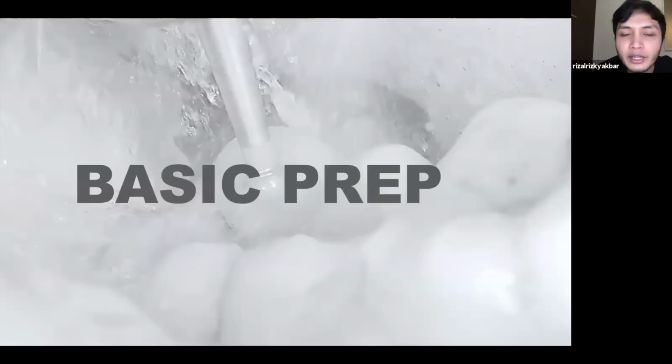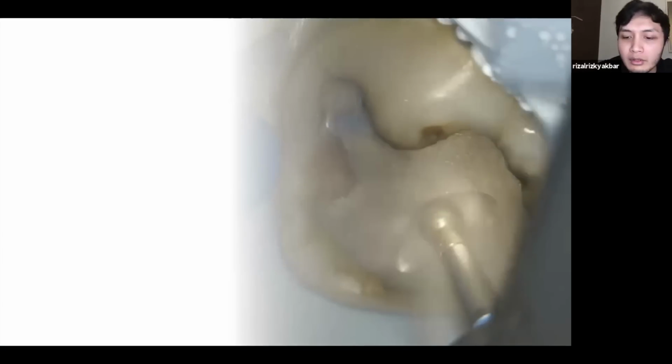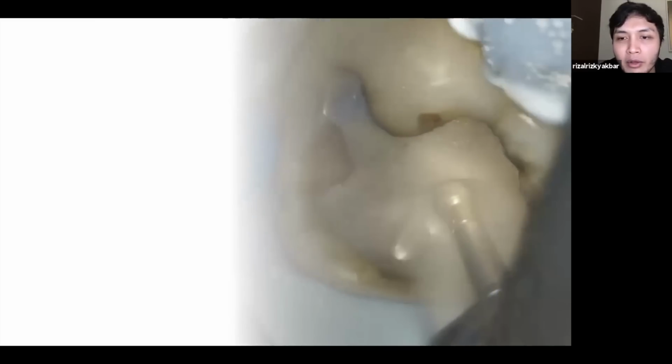Okay, that's the simple anatomy. How about the basic prep? I think I don't need to explain further about the preparation because you already know about this. For the initial prep, I always use the diamond burr. As you can see here, the diamond burr, the round burr.